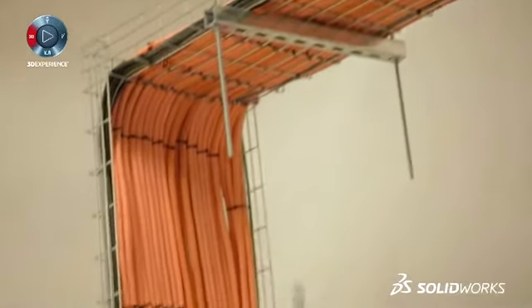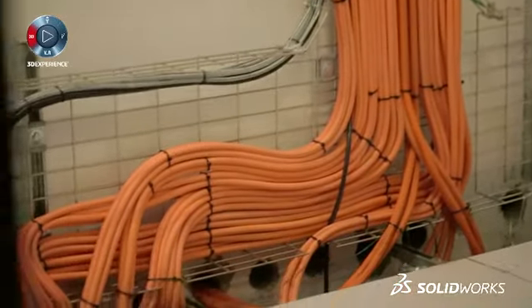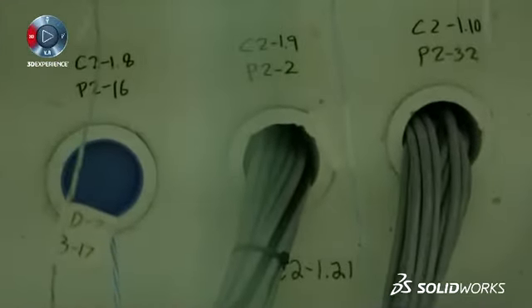There's about 18 miles or more of electrical wiring through the system, used to connect everything from temperature sensors to high power magnets. This controls the magnet interlocks. When we have 18 miles of cable, it's very important to keep track of every piece of cable that you have. When you look at one end, you may not know what the other end connects to. We have to hand to somebody, say, pull cables XYZ through this hole. This is beyond just maybe harnessing into a car or an item like that. This is harnesses of harnesses of harnesses. It's very large.